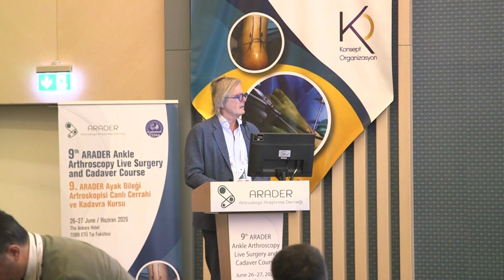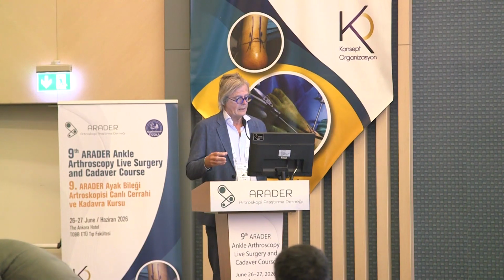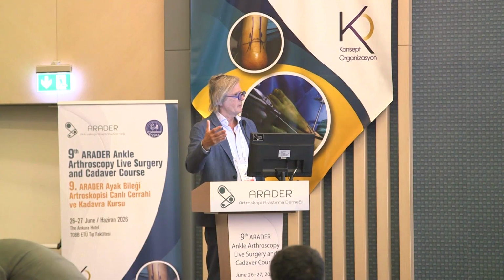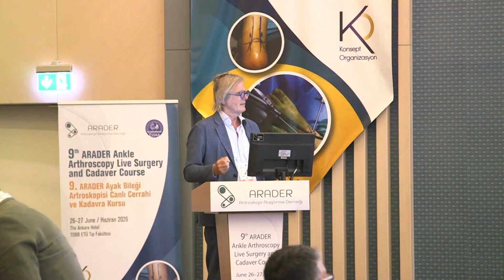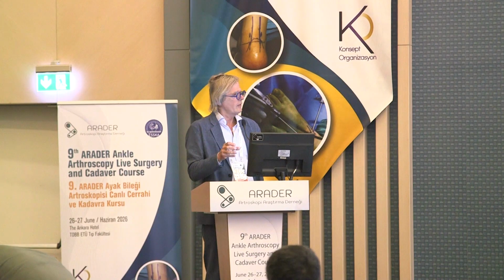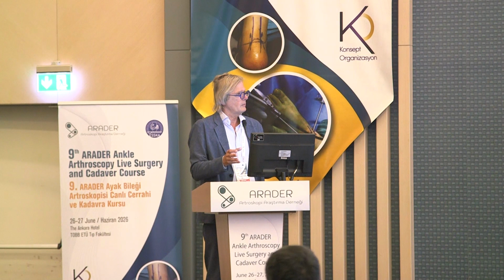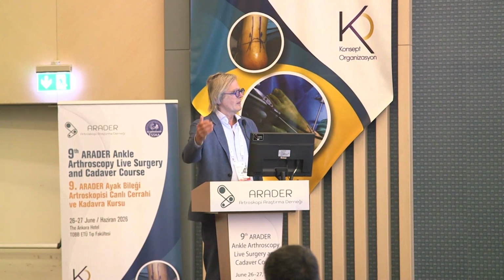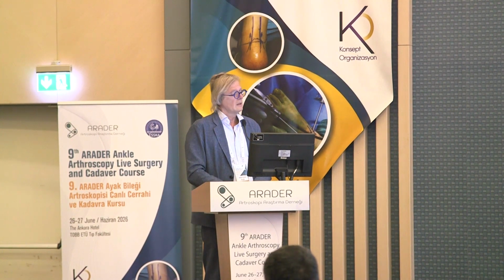Yeah, in fact, I have a very low threshold to also go posterior. Because the patient has capsulitis at the back, of course, after a fracture, or, I mean, there's also the rupture of the posterior capsule. Yeah, so the bleeding and scar formation there. So you have the scar at the back, and the osteophytes or the impediments in the front. So only taking away the impediment in the front doesn't help at the back. So in order to have the best result, you have to go both at the same time. It's a very rewarding procedure.